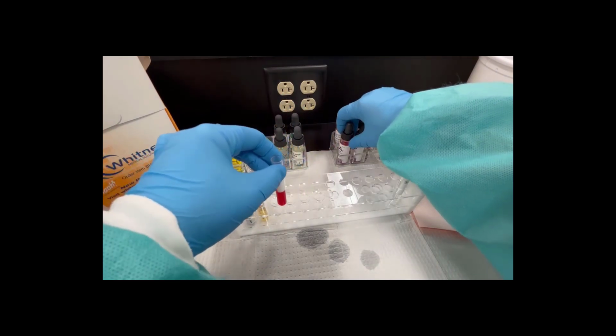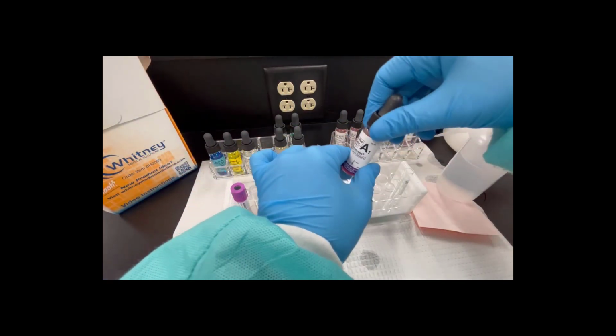Make sure to put the lids back on reagents, as they are very expensive and we don't want to lose them.